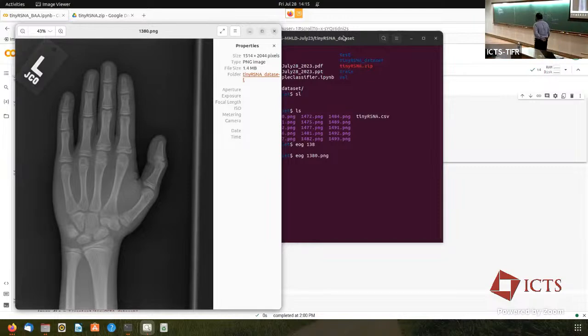Now, let me say a few words about training the network. Remember last time I said, once you have a network, think of it as an input-output transfer function. And the output is compared to the ground truth. You compare this ground truth and you change the weights in the network based on how much the ground truth differs from the output. So the loss function is some function of the output and the ground truth.